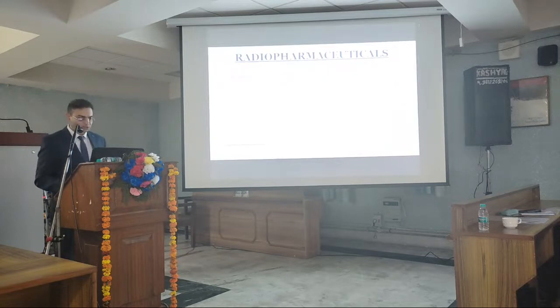So, for radiopharmaceuticals, we have options of various radiocolloids, which include sulfur colloid and nanocolloid, the most common, and the newer tracer, which is a receptor ligand type of tracer, which is tilmanocept. Now, one important consideration is particle size.